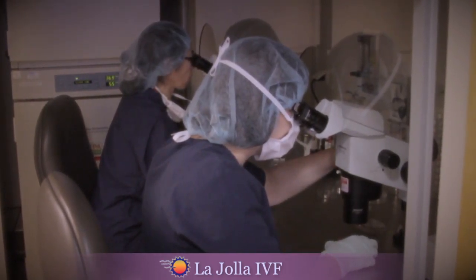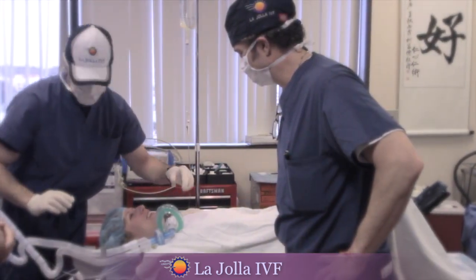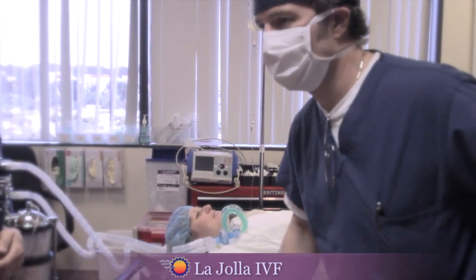The surgery itself is usually a very short procedure, no more than 10 or 15 minutes. After the procedure, our patients wake up and rest comfortably in our recovery room until discharged home.